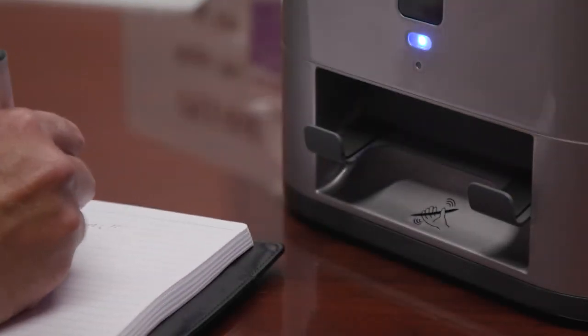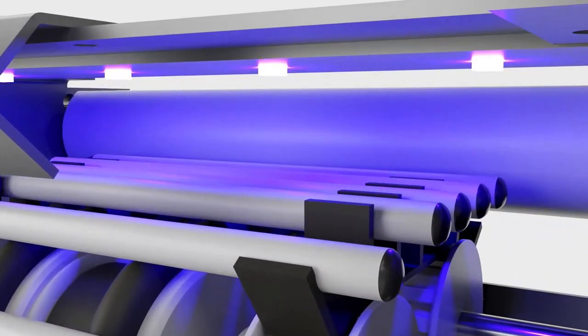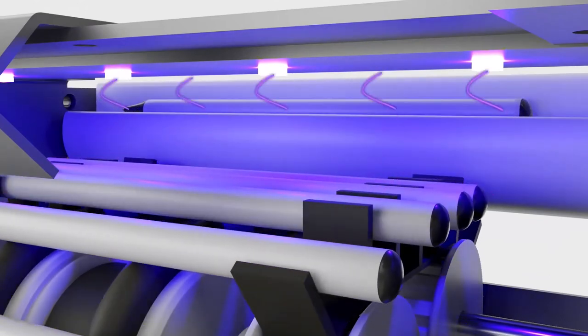There have been many studies out there demonstrating the fact that germs, bacteria, and viruses live on communal pens. Wiping pens isn't a good idea because they're wet and it takes time to do that, so a dry sanitization or sterilization technique is UVC light.